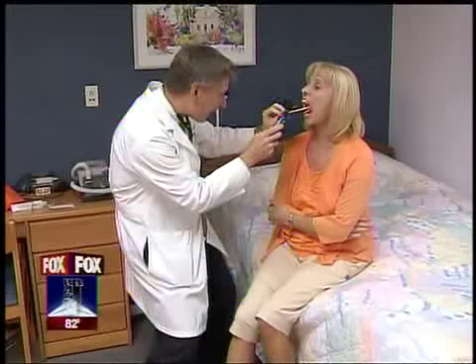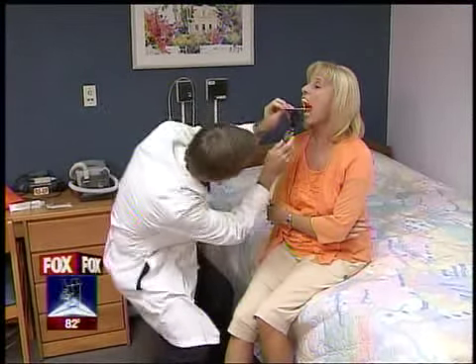Dr. Glenn Adams is a sleep specialist at Sarasota Memorial Hospital. He says no question CPAPs work, but do have drawbacks for many patients. It tethers you to a machine that you have to wear. It's cumbersome, it's bulky, it blows air in your face.